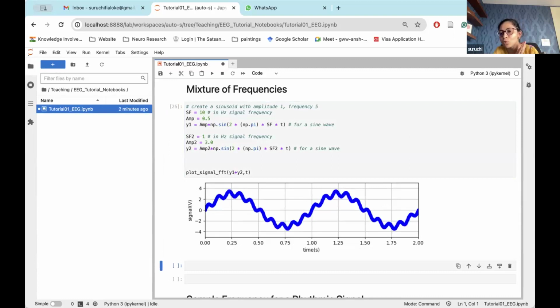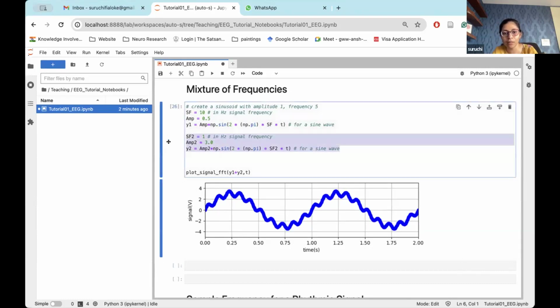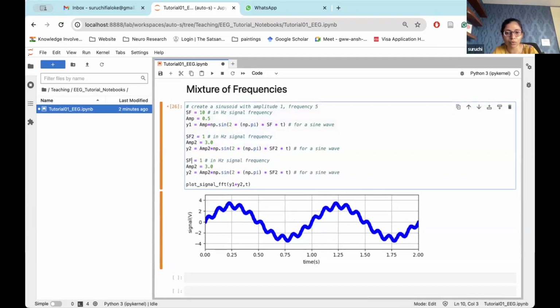That is more like an EEG signal. And it's not even just one or two, it could be multiple. So now it becomes very challenging and it'll look really weird because you will keep adding multiple, 4, 5, 6. They're not pure frequencies either. So let's do one more, 3. That's why you need Fourier transforms. We'll come to that.